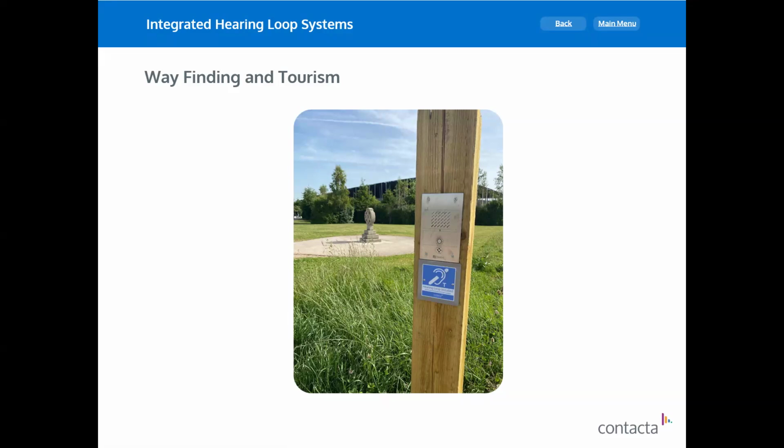And you can hear the audio and walk out to the next exhibitor, maybe 200 or 300 feet away, and you can repeat the same here. So you will need one of these systems for every audio source that you have on every exhibit item. So that's an outdoor application, but it's utilizing the audio source and the power source that's already there. So pretty straightforward installation.